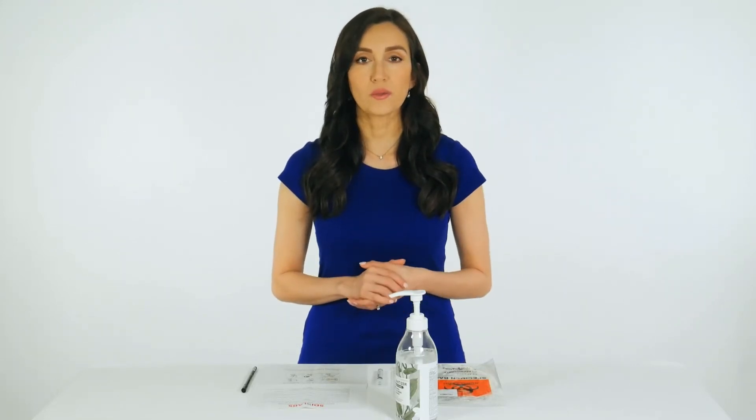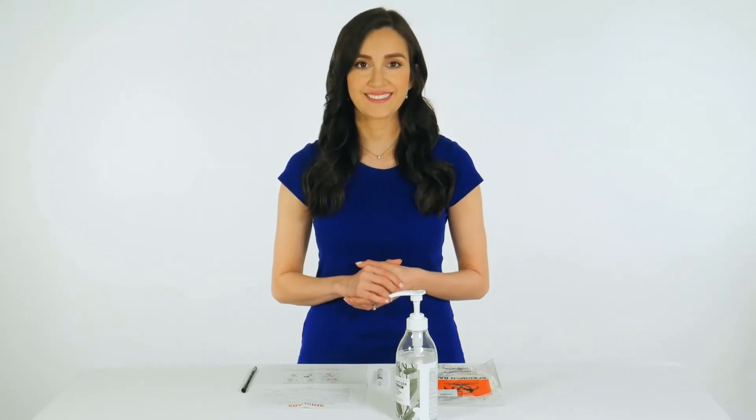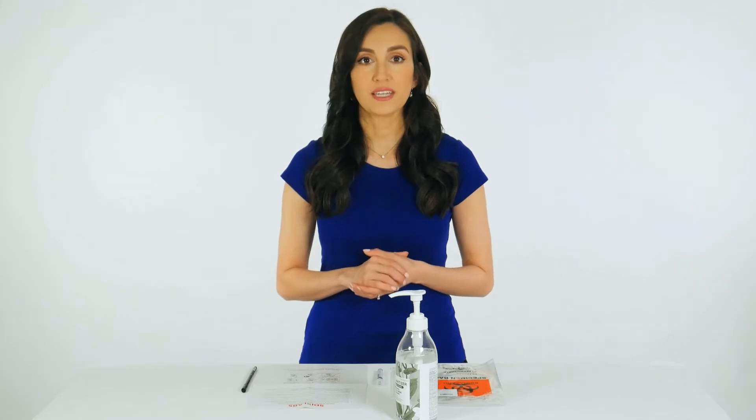Hello! Today we will walk you through collecting your sample for your SDI Labs Interior Nasal Swab Specimen Collection Kit. SDI has worked to simplify specimen collection for our patients using these swabs. The specimen collection kit is simple, straightforward, and easy to use without compromising on turnaround time or accuracy.